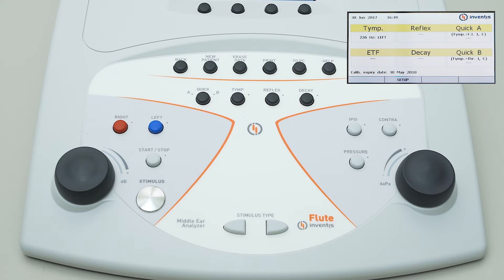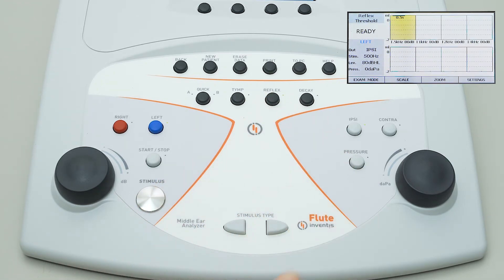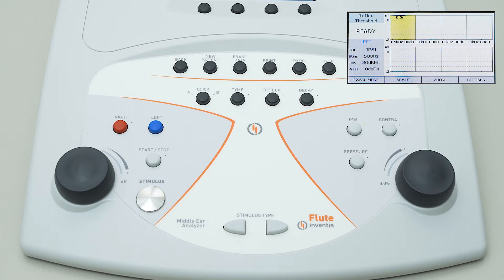As with the tympanometry test, in order to conduct the acoustic reflex test, the operator has to press the dedicated button on the keyboard. The test can be conducted in different modes: fixed intensity, automatic threshold, growing intensity, and — only with Flute PLUS — manual mode. The current selection is highlighted at the top left of the screen.